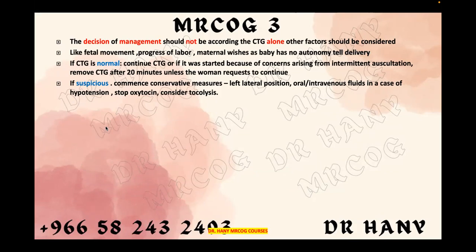Suspicious, so you will do one of the conservative maneuvers: left lateral position, oral or IV fluid. Take care if the woman has hypotension, stop oxytocin or consider tocolysis.